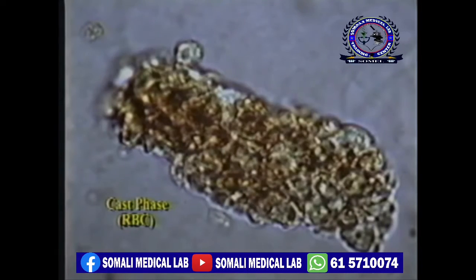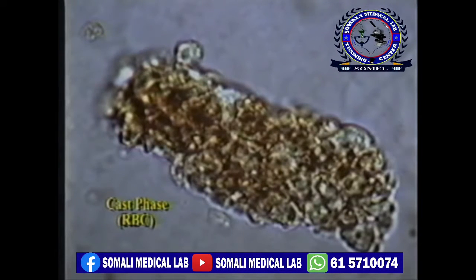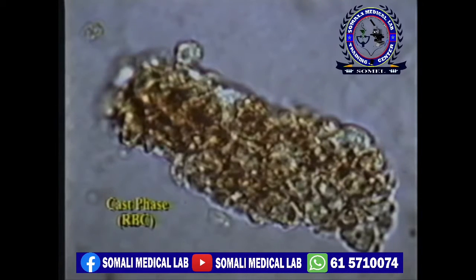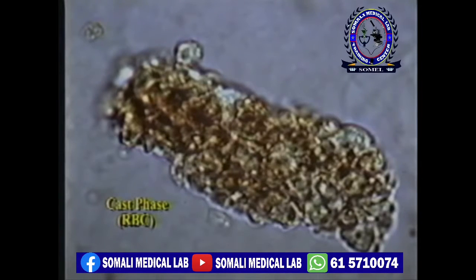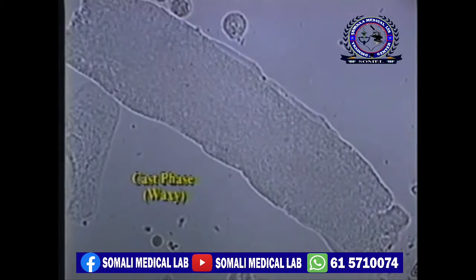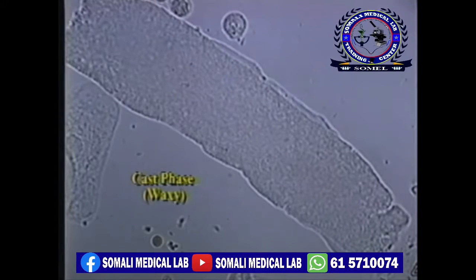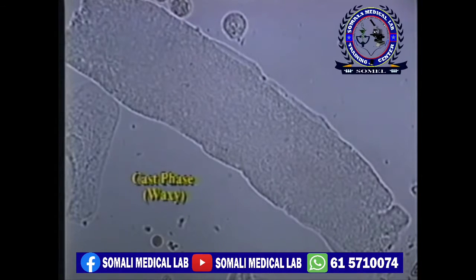In this slide, we see a red blood cell cast under high power phase microscopy. These are a very important finding and therefore should never be missed. These are a rare but significant abnormality associated with renal disease. In this slide, we see a waxy cast, which is the other significant occurrence associated with renal disease. This is under high power phase.